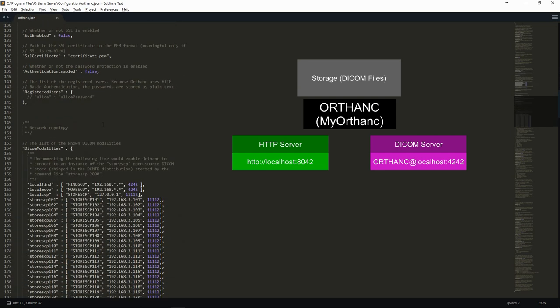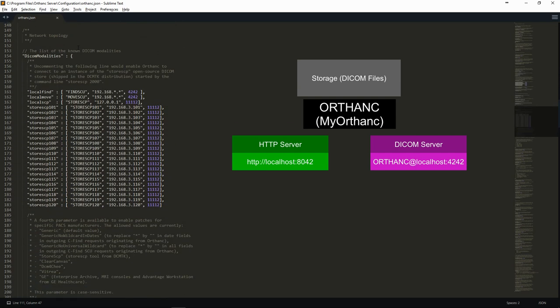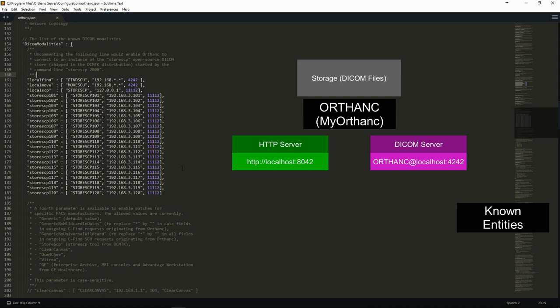Finally, we can define known DICOM entities with which the system will be able to communicate. Here, for instance, we added a store SCP DICOM entity for each of the computers in the lab's local network. As we will see later on, this is necessary to be able to execute C-MOVE operations.